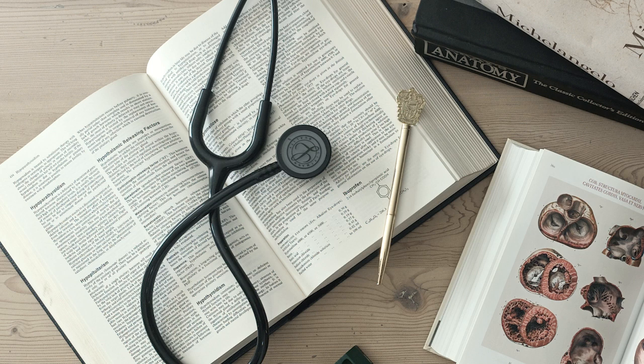Exactly. So our crucial ECG analysis approach for APCs is this. Always analyze the small complexes, the P waves, first. Look specifically for abnormal P waves that are different in shape or occur early. Do not allow your eyes to be drawn to the large QRS complexes initially, even if they look strange. The implication here is that if an abnormal P wave is present, the arrhythmia is definitively supraventricular in origin. It comes from above the ventricles. Okay, find the early P first.